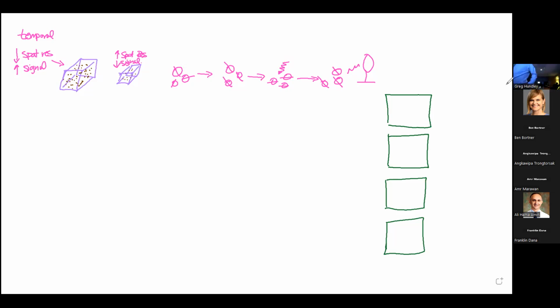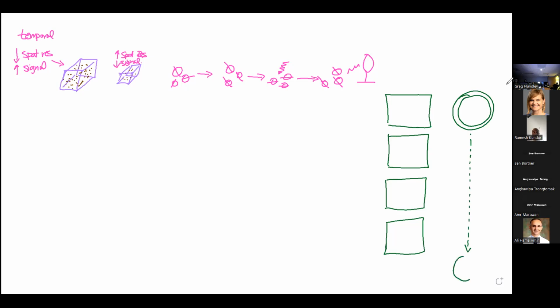So over here on the right side of the screen are the frames of the movie. All right. So picture the left ventricle. We're going to have way out here at end diastole the first frame of the movie, and then we're going to work all the way down in the frames of the movie to end systole, right? Looks something like this. So here's our LV right here. So how are we going to make that movie? How are we going to make those frames?